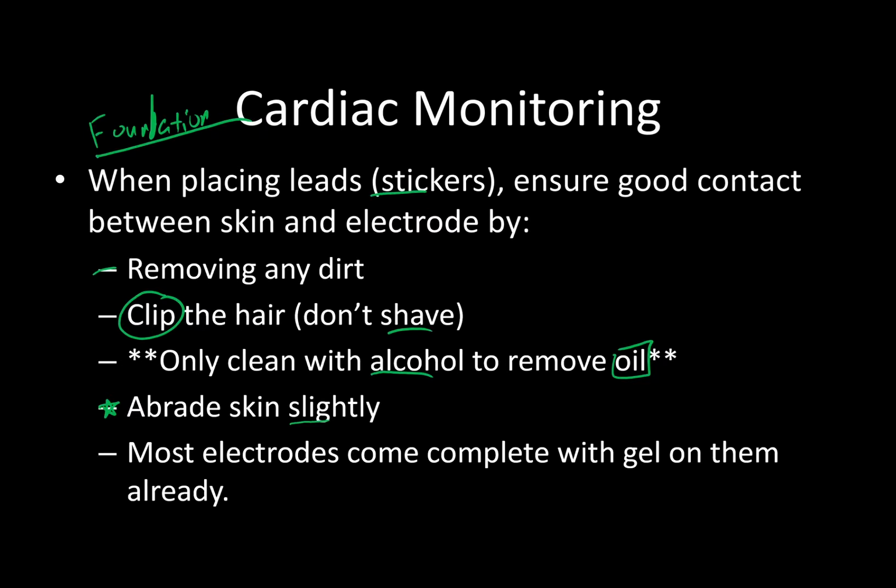Back in the day, gel electrodes didn't have gel on them, but nowadays most of them do. If you really want to get creative, you can use the ultrasound gel like you do for bladder scans, put a little dollop of that on there, and that might actually enhance your signal.